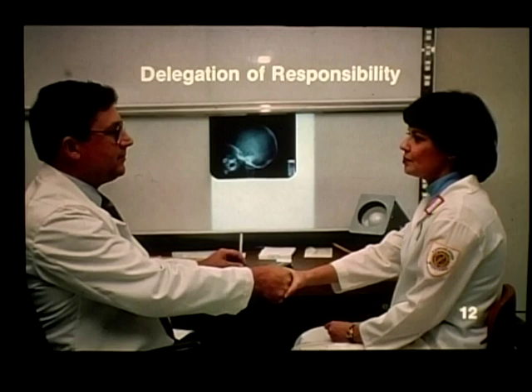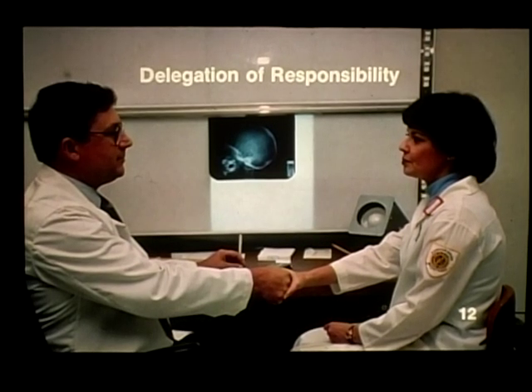Larger institutions often employ 1 or more persons specifically designated as quality assurance technologists. In some large university hospitals, a physicist or a radiological engineer may be designated as the person responsible for the quality assurance program.